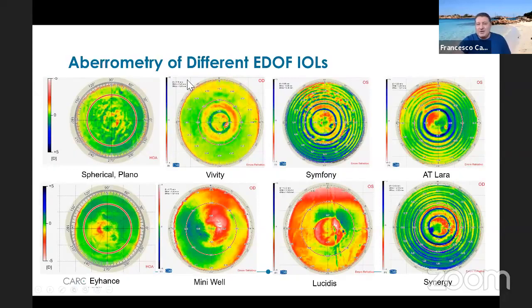But at the same time, you may want to compare, for instance, how a refractive shaped EDOF IOL transmits the light compared to traditional diffractive patterns. Again, you may really not only be told by the patients, but you can really appreciate from a diagnostic point of view why this lens is definitely closer to a monofocal than to a diffractive in terms of halos and night vision problems.